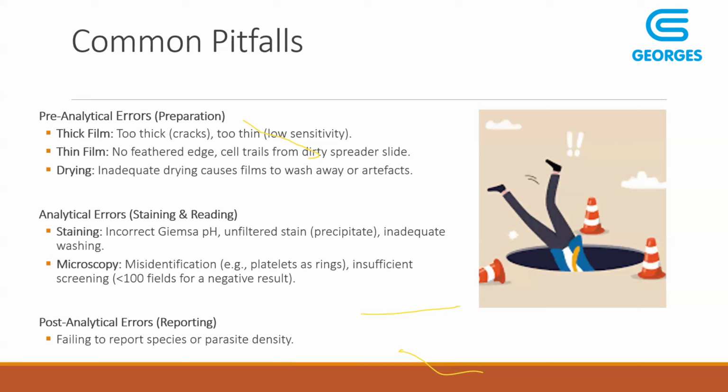Thank you, Peter, for that. The vice versa can also happen, by the way, whereby the RDT is negative and the slide is positive. Depending on the type of kit you are using, some of them do not detect the rare species, like Plasmodium knowlesi, things like that. So the opposite can also happen.